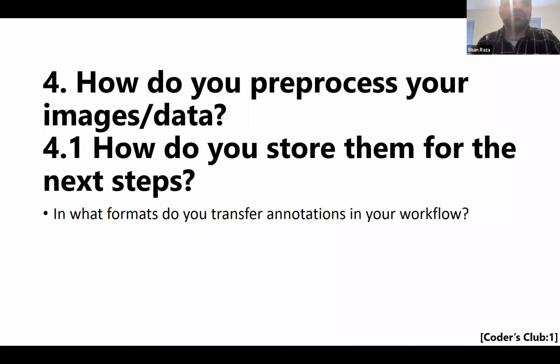I agree with Scott. It's a case of efficiency versus ease of use. In my opinion, streaming formats like TFRecord have been much faster, even compared to H5, which I was using before. But when you get to Torch and you just want to load the images, it's much easier to implement, much faster implementation. But again, efficiency versus ease of use. That's what you're looking at here.